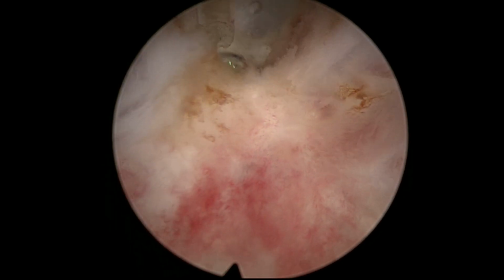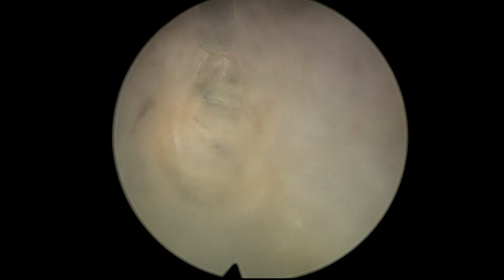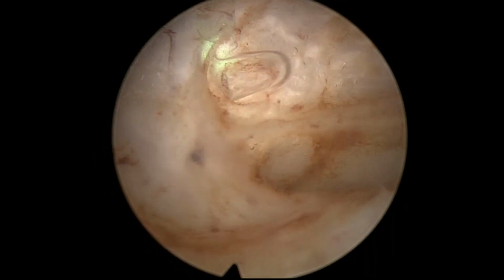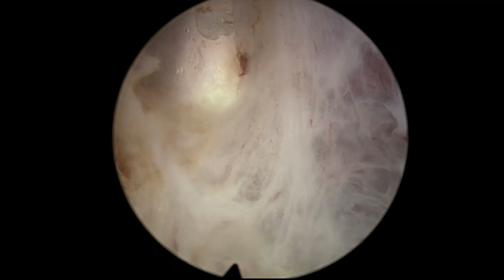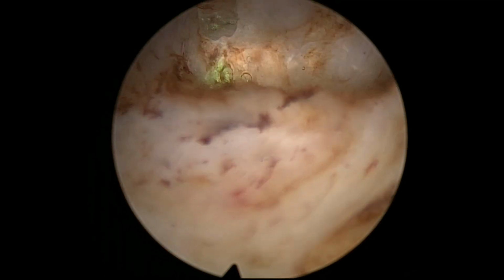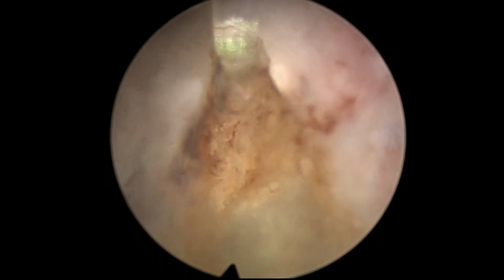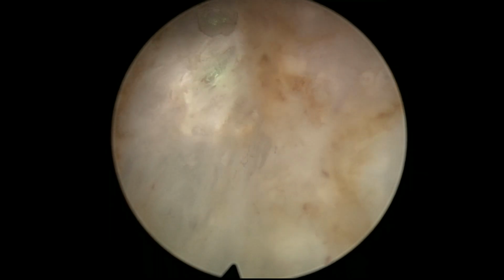And maybe the pulses are not opening the plane as efficiently as I would get with one of these pulse modulation, either MOSES or virtual basket lasers. But as you can see, the cutting properties are very much enhanced, I think. It's an excellent cutting. The hemostasis is very impressive.